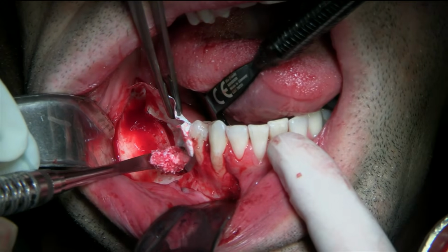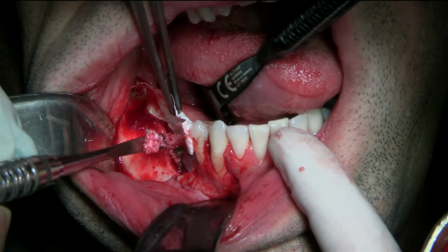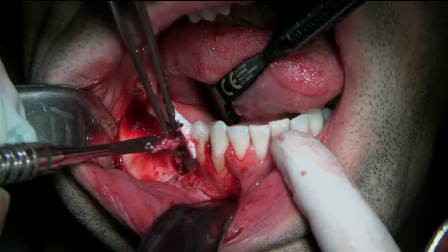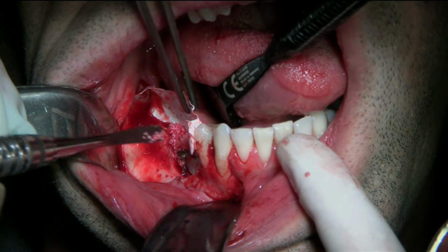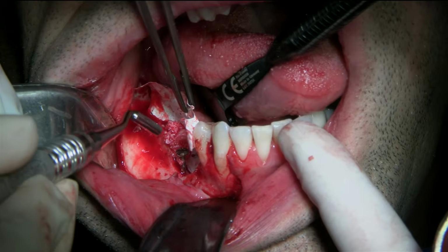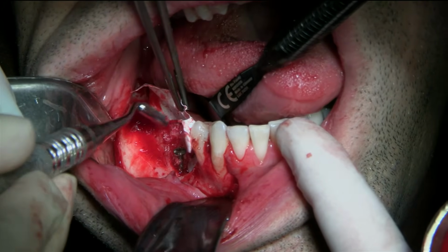You see the bone? Good visual. So I'm going to drop the bone lingually. And on the same instrument I have the condenser. That's what I call the Joe 5.